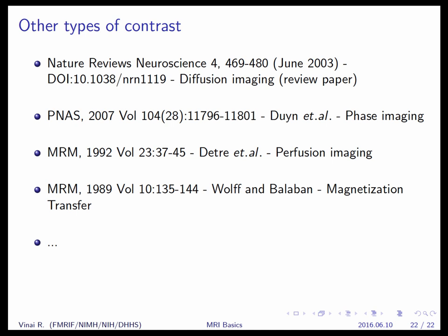Okay, thank you. The individual images are taken in about 50 to 100 milliseconds. So when you're doing a BOLD experiment, the individual images take about 50 milliseconds to acquire each one, so you're getting a snapshot of that moment. But the BOLD responses, like Peter was saying, take seconds to develop and go away. So you can't really measure the BOLD response in what's happening within those 50 milliseconds, because it's all blurred out by the blood flow. It's just the difference between the before and after, and it's relative to itself. The voxel is measured relative to itself.